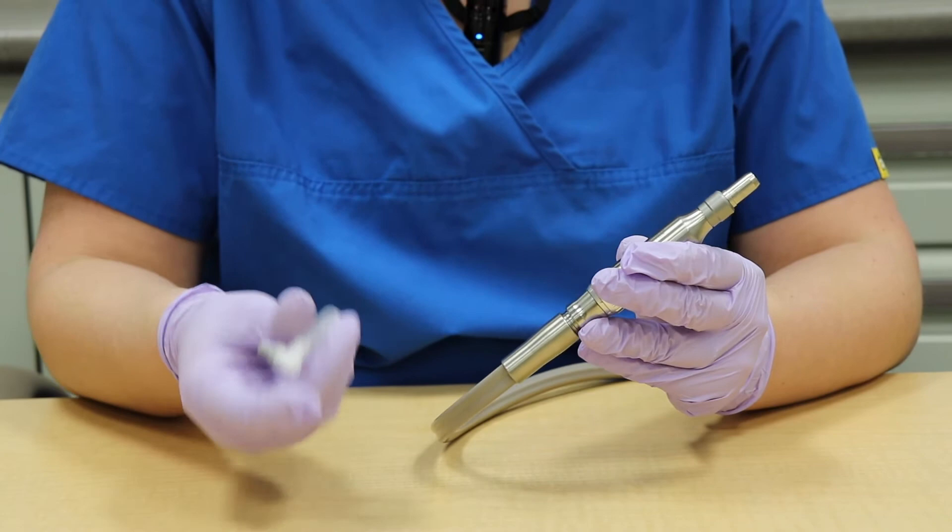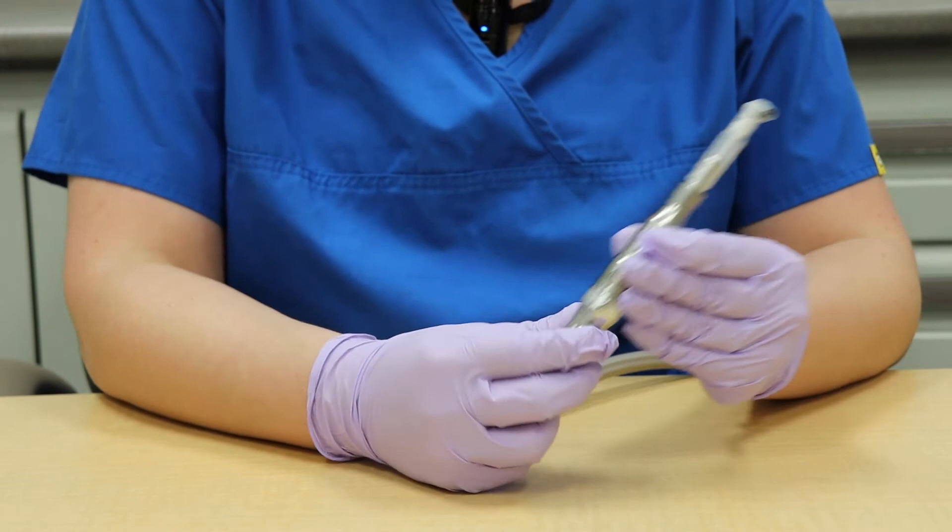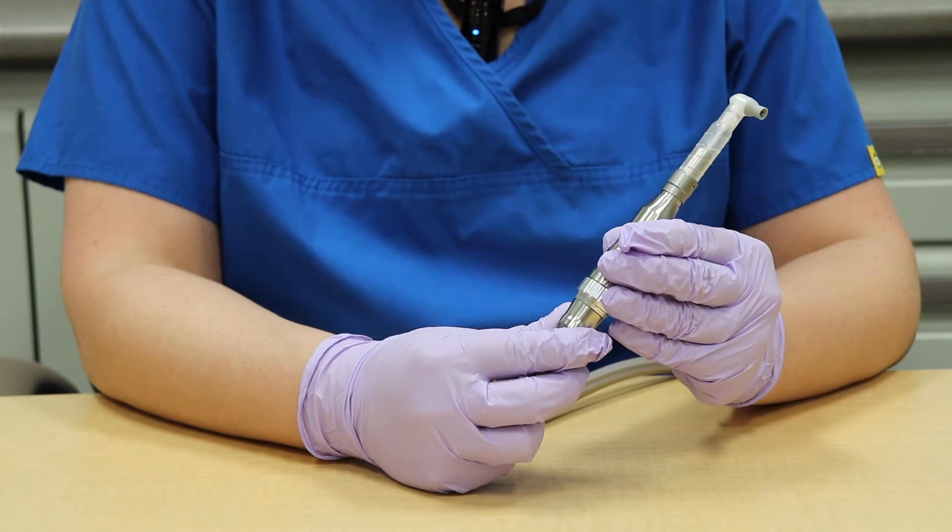If the angle still is not spinning, verify proper angle installation. The profi-angle should be seated completely and the locking ring should be touching the bottom of the profi-angle to fully engage.